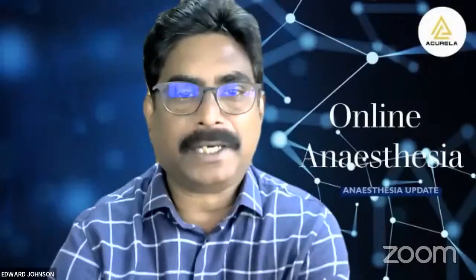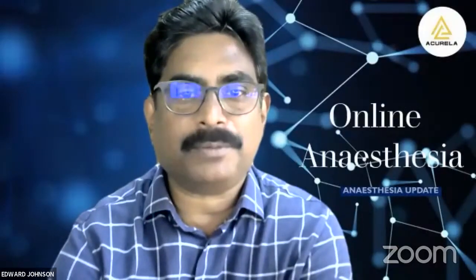Yeah, that's a very tricky question. Which video laryngoscope should they go for? The video laryngoscope in which they have maximum expertise, they should purchase that one. Don't go for a newer one they have not been trained on. Or if you're purchasing one, get adequate, optimal training before going for difficult cases. Start with normal cases first and then go for difficult cases, and make it routine. If you have a video laryngoscope, make it routine. So the type is not important. The training you get is more important.